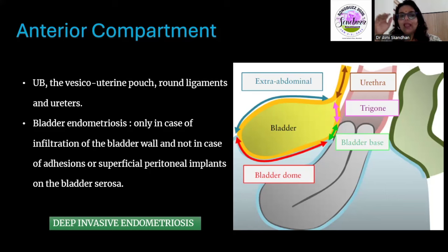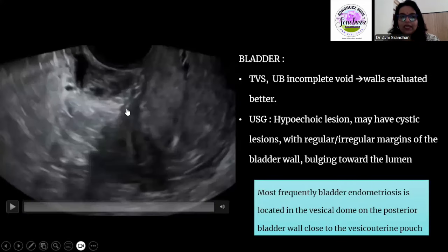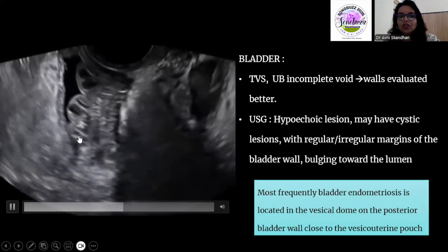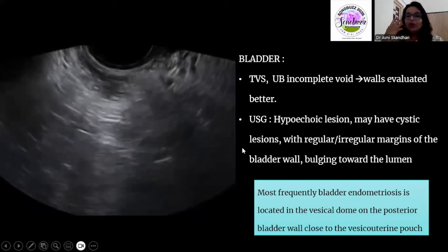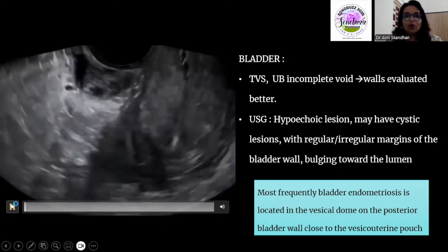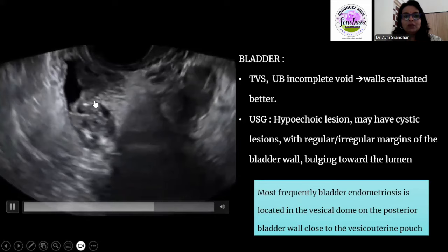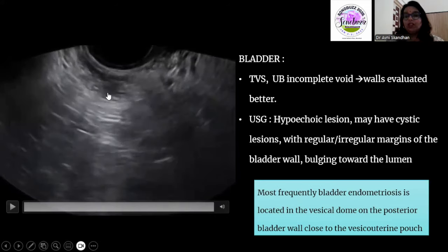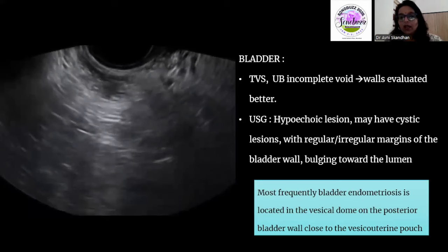That is how deep deposits appear in all locations. Additional pointers favoring endometriotic deposits include the fibrosis they cause and the changes that fibrosis produces in adjacent structures. Looking at the appearance in the bladder, you can see a structure growing within the bladder — a deposit growing from the bladder wall intraluminally with cystic spaces. It is very important that an endometriotic deposit touching the bladder wall should not be labeled as bladder endometriosis; bladder endometriosis is only when it has invaded the muscular wall or is seen intraluminally. Supporting clinical evidence includes a history of cyclical, painful hematuria.